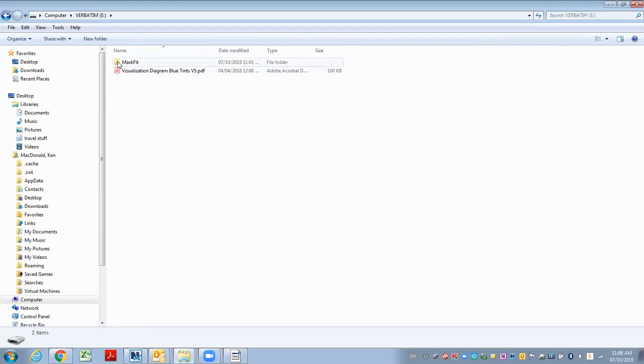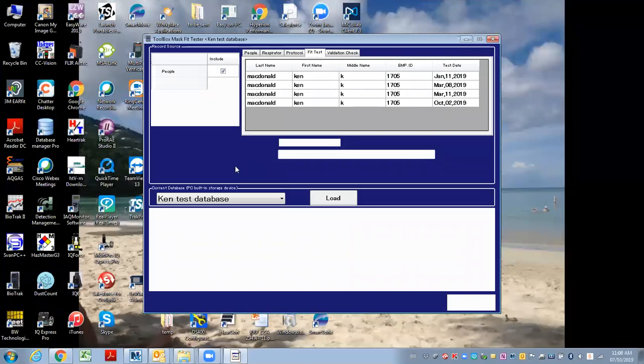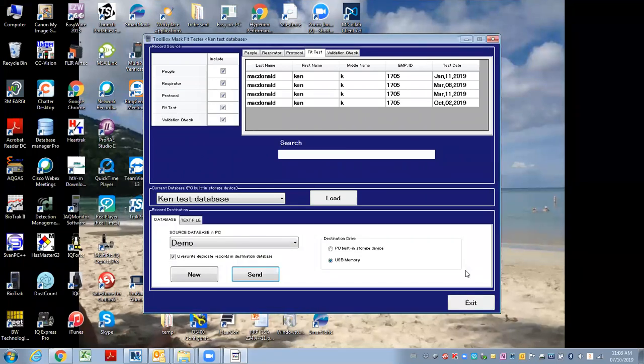I had another file on here, but it created a folder called mask fit, and my database file is in there. So I can take the flash drive now and go out and do fit testing. I could add people and respirators, and I've got my fit tests as well.